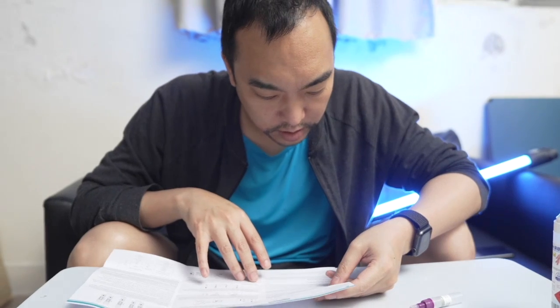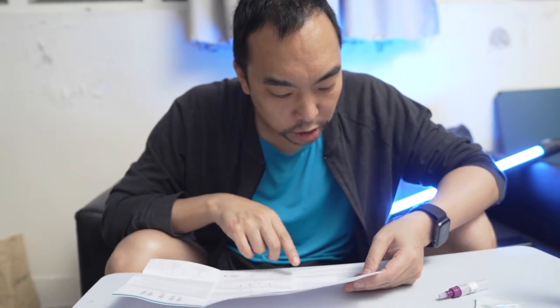self-testing kit. Well, the COVID-19 antigen detection kit, colloidal gold, is a qualitative membrane-based immunoassay for the detection of SARS-CoV-2 nucleocapsid protein antigens in human nasal swab specimen. Bet you didn't know that, and I bet you didn't want to know that, but now you do. This is dedicated for medical laypersons, like me. I'm a medical layperson, aged 18 and over, which is also me, as a self-test.